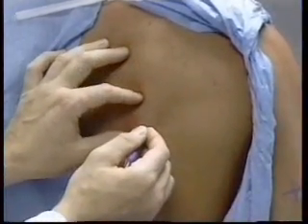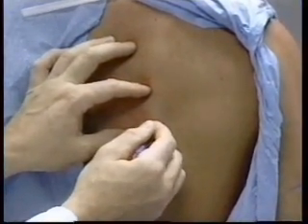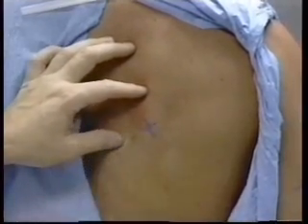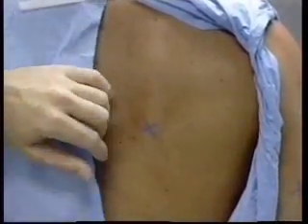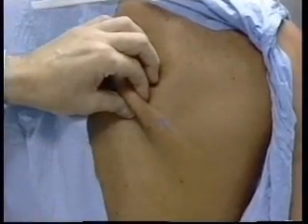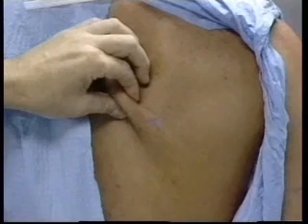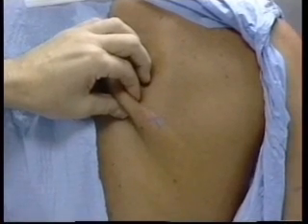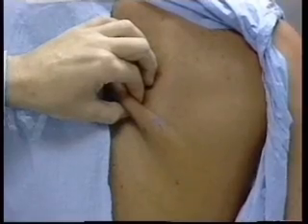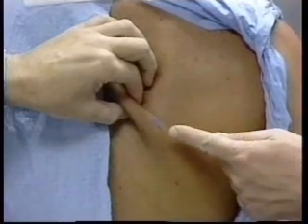Prior to measuring the skin folds, each site is carefully marked on the right side of the body using either bony landmarks on the trunk or midpoints between well-defined bones on the limbs. For each site, the skin fold is lifted up at a location two centimeters or approximately three-quarters of an inch above the point at which the caliper tips will be placed.